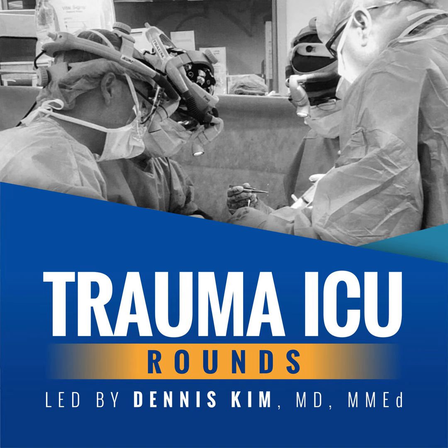So just because someone is having thick, purulent secretions, that's not a contraindication to extubation unless the cough is borderline or weak. The other important thing we want to assess for is the risk for post-extubation stridor, and we'll talk about this in more detail in a future episode, but certainly there are going to be certain patient populations in whom we are concerned that upon removal of the ET tube, there is the potential for vocal cord edema, whether this is related to details surrounding their initial intubation, particularly if there were multiple attempts, or if it was a difficult intubation, or related to laryngeal injury, the duration of endotracheal tube insertion, or potentially and rarely tracheal stenosis or lesions.